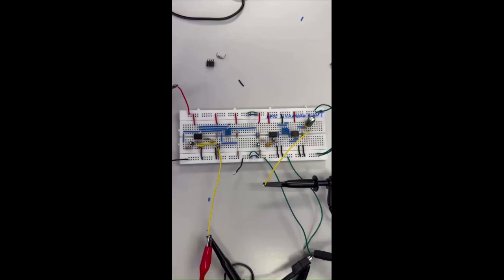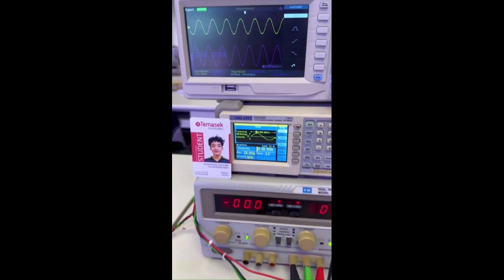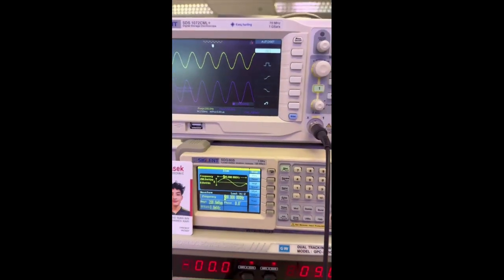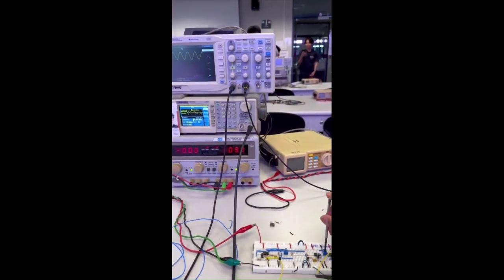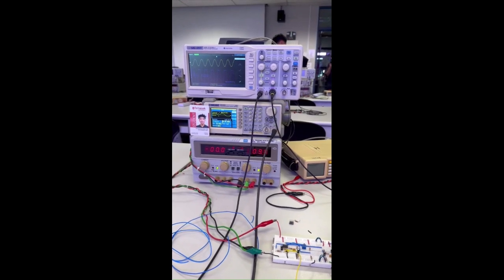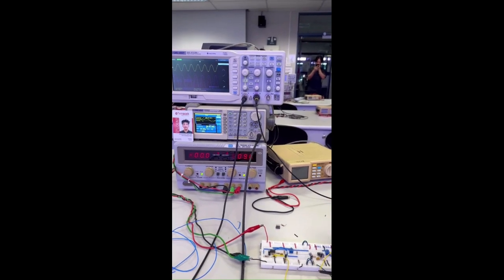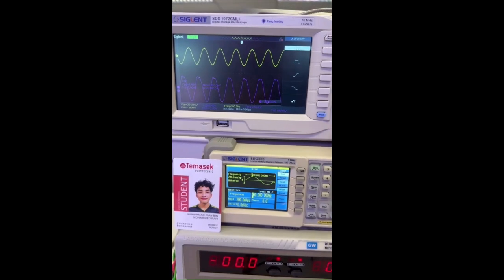This is me measuring TP5, the output of the whole circuit, and there we have the sine wave of the output TP5, peak to peak 5.76 volts around there with 200 Hz. And this is me adjusting the potentiometer at TP5 at block 4. As you can see, it gets clipped, so we have to choose a suitable resistance for the potentiometer.